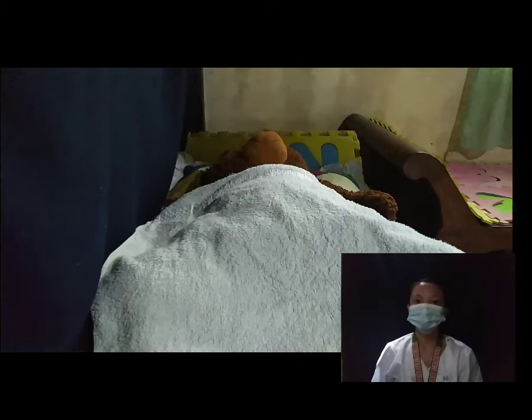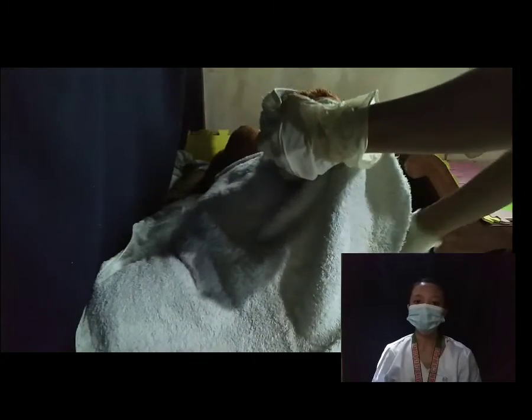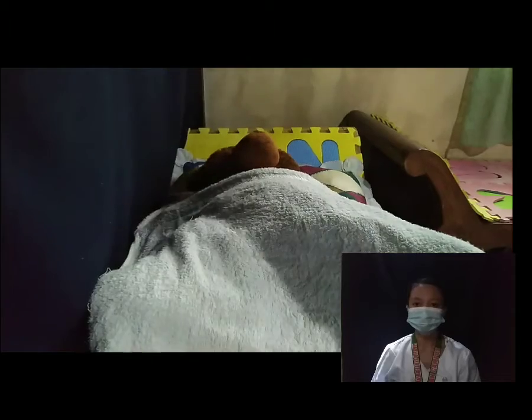So before we start our procedure, make sure that we have all the necessary equipment that will be needed in the entire process. Next, we should position the patient depending on the gender. For a female patient, on back with knees flexed and thighs relaxed so that hips rotate to expose the perineal area. Alternatively, if the patient cannot abduct the leg at the hip, the patient can be side lying with upper leg flexed at knee and hip, supported by pillows. The rationale in this step is that the patient should be comfortable with perineum exposed for ease and safety in completing the procedure.